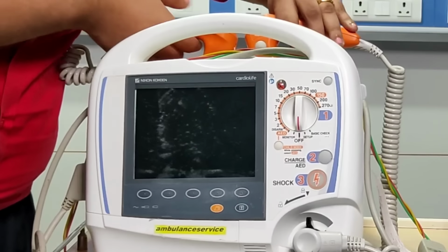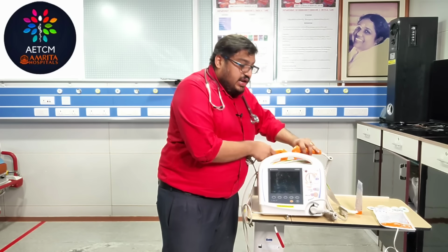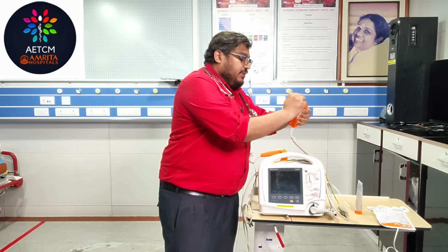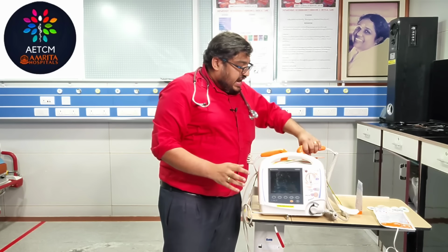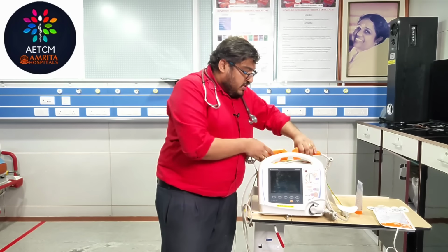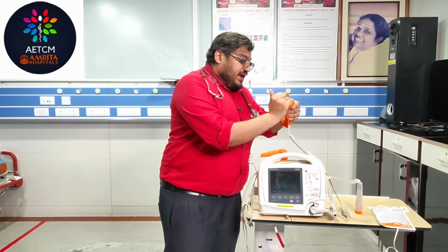Then you will have two paddles here. One paddle you need to keep over the right side of your chest and one paddle over your apex. And you can see something here. So these are the pediatric paddles. When you flip this side, you will be able to see the pediatric paddles. And again in pediatrics, the dose is 2 joules per kg for defibrillation. So when you are planning to go ahead for a pediatric age group, you have to remove this and use this paddle. So this is the pediatric paddle.